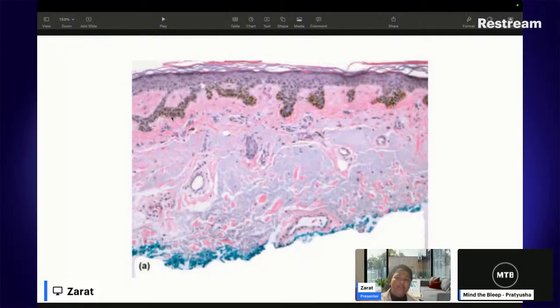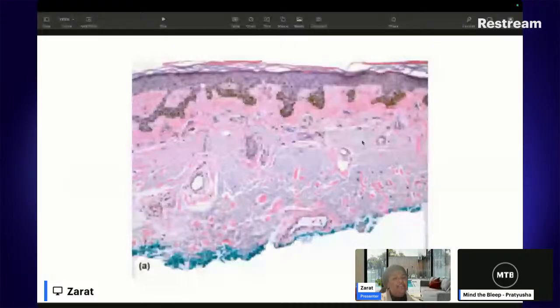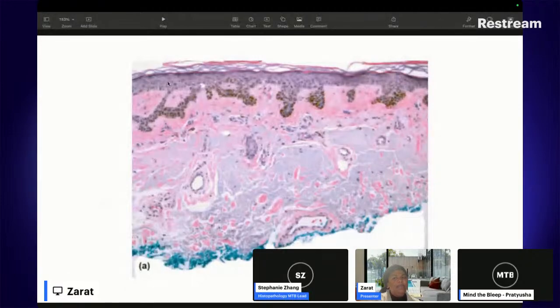You can see there's a lot of pigmentation along the keratinocytes in the basal layer. Lots and lots of brown pigment. And in the dermis, again, we can see these purplish bluish haphazard areas, which is our sun damage. So we know it's sun damaged skin. We know the abnormality is in the epidermis, and that has caused these rete ridges to become quite long as well.